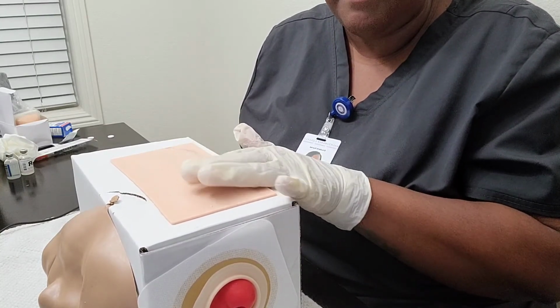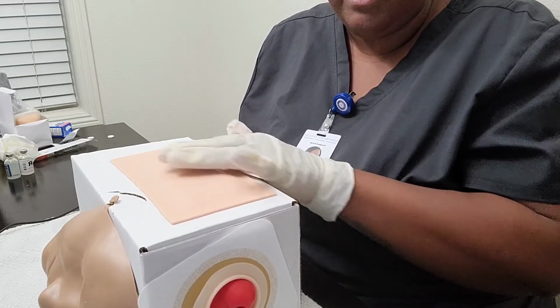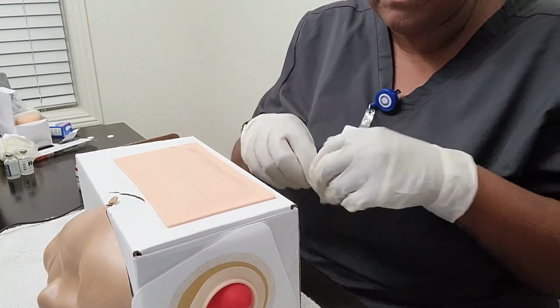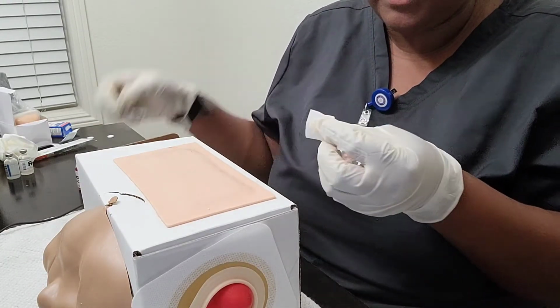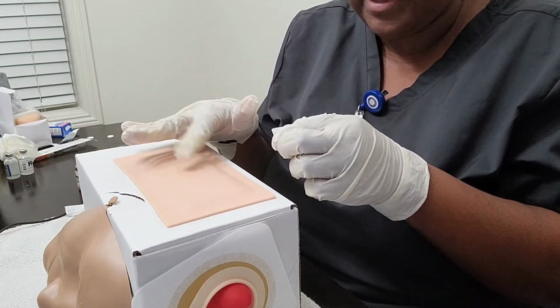And I will select the appropriate site and make sure that it's the correct size, and clean the area with the alcohol pad, the center of the site, which is right here.